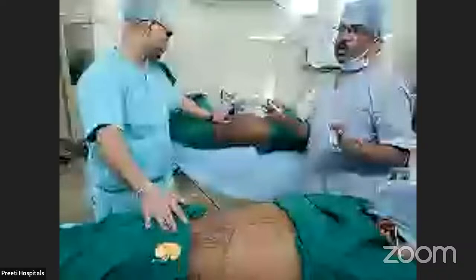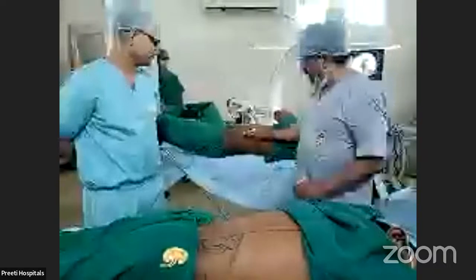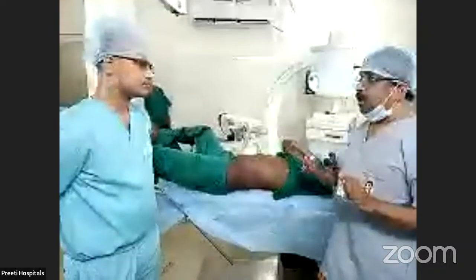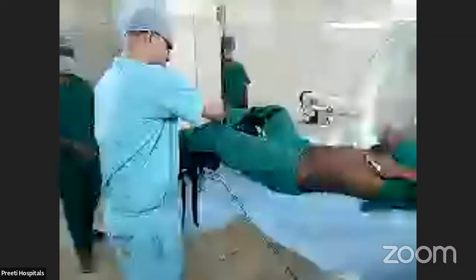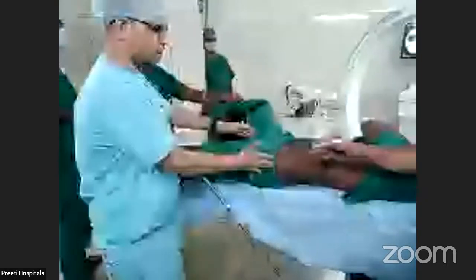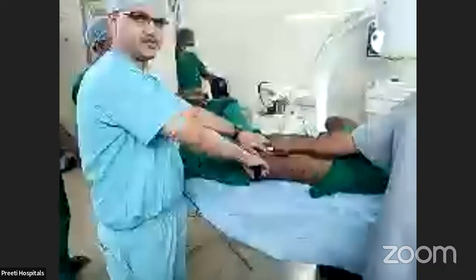So is it clear, Prem? For all inferior calyceal stones, unless it is projecting laterally, unless it is an isolated inferior calyceal large stone, prone PCNL. Whereas if you want to do supine, keep the leg straight. Now by keeping that, what happened? This iliac crest moves medially, we got some space to move. And if the calyx is more laterally faced, then also we can do the stone surgery in these patients.